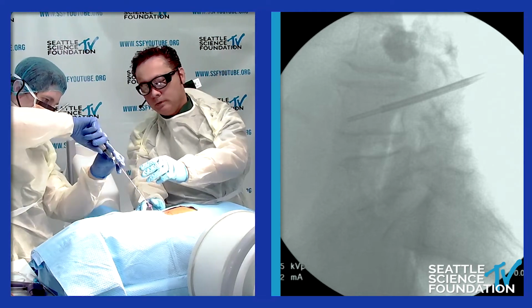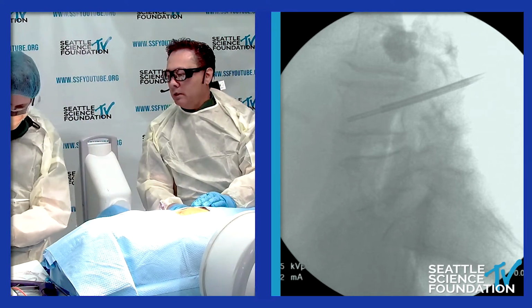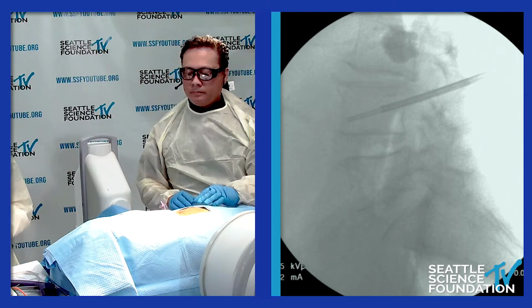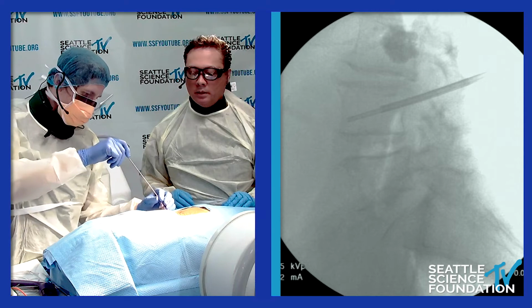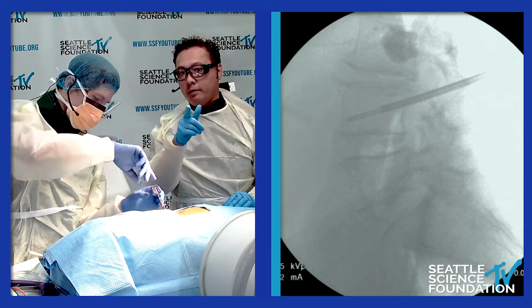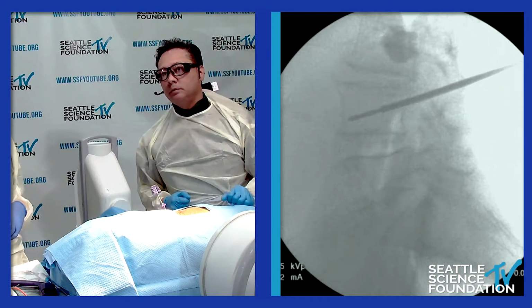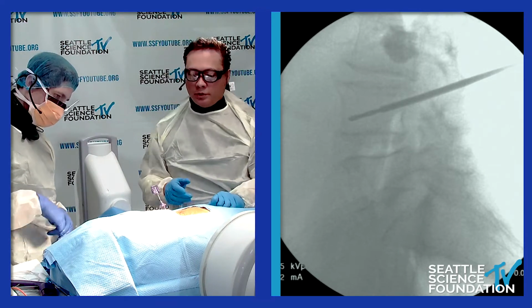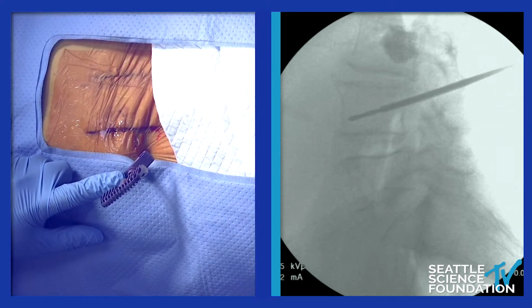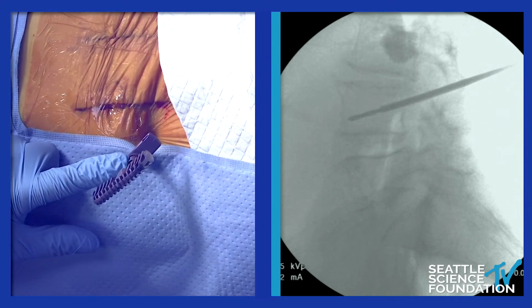So this helps to core out the area. So what did you just do, Glenn? Did you take a biopsy there? A lot of times, we're definitely always sending it up for pathology. So this drill helps to core out the area. Can you see it on the camera? Yeah, that's great. Let me give a lateral view of it.